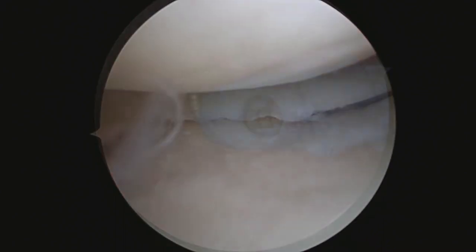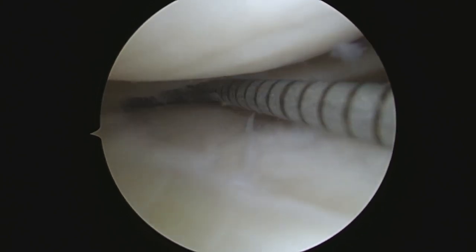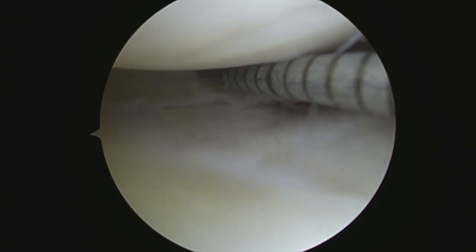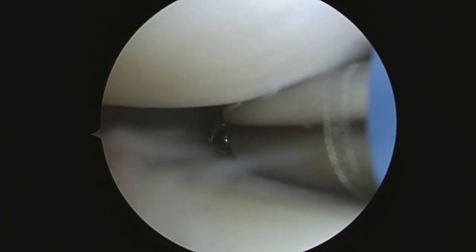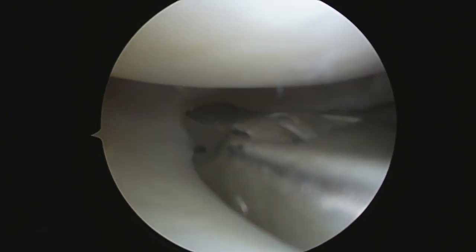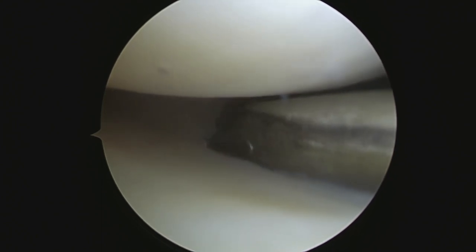We're going to take a tour around you. Okay Roselle, here we're in the lateral compartment of the knee, the outside. You have some arthritis here as well - not awful. Here's your lateral meniscus; this is what a meniscus should look like. Your popliteus tendon is behind there. You do have some fraying of the edges, so we're going to trim that up with a shaver just to make sure there's nothing that's going to rub. Just trimming that little edge - nothing major. Just a minimal meniscectomy here, nothing significant.